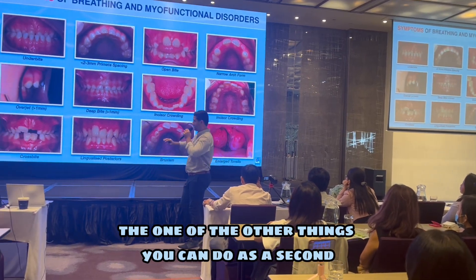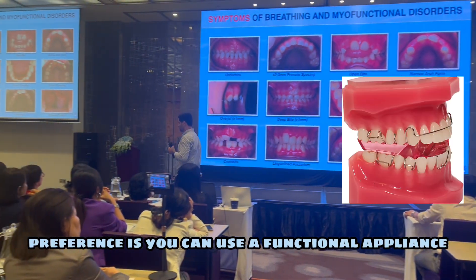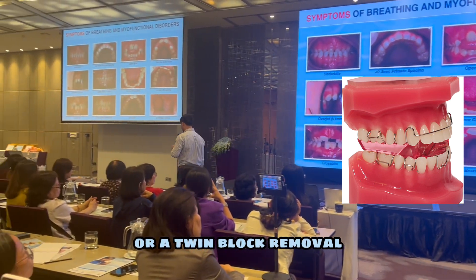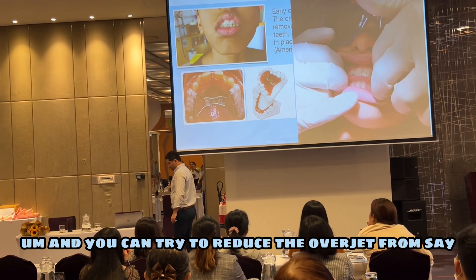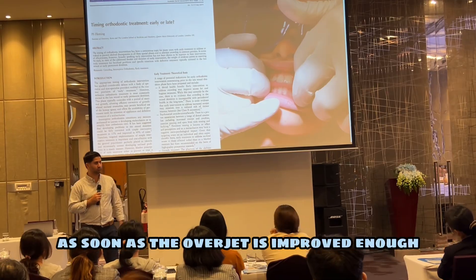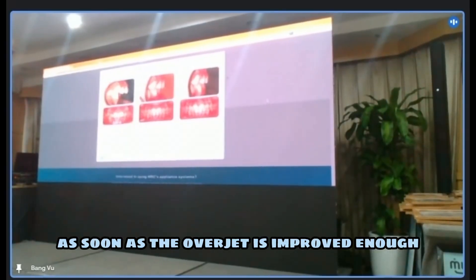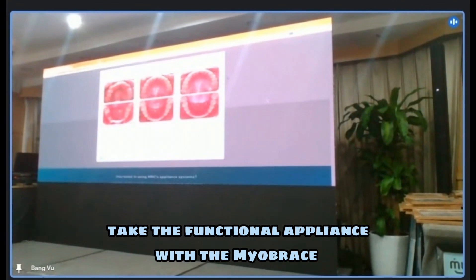One of the other things you can do as a second preference is you can use a functional appliance, like a fixed functional appliance or a twin block removable. And you can try to reduce the overjet from, say, 12 millimeters to, say, eight or seven millimeters. As soon as the overjet is improved enough to be able to fit my brace in, take the functional appliance out and put the my brace in.